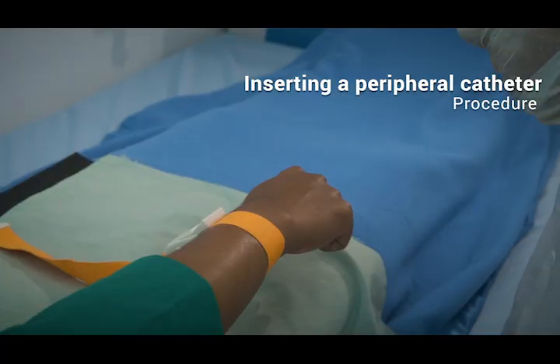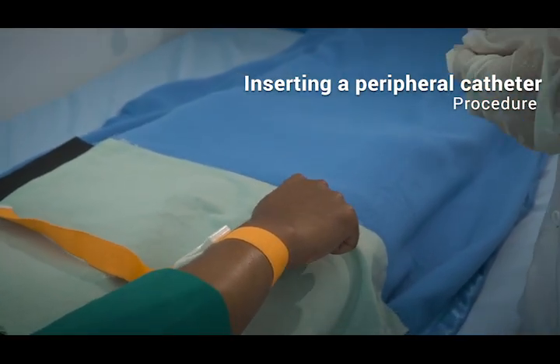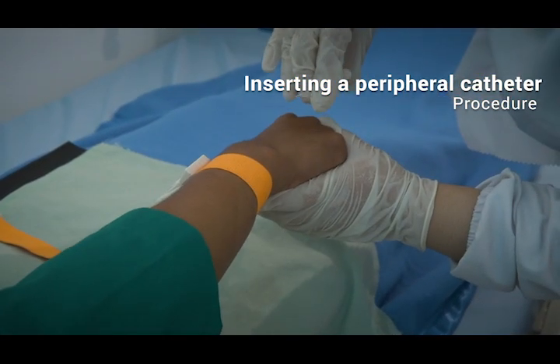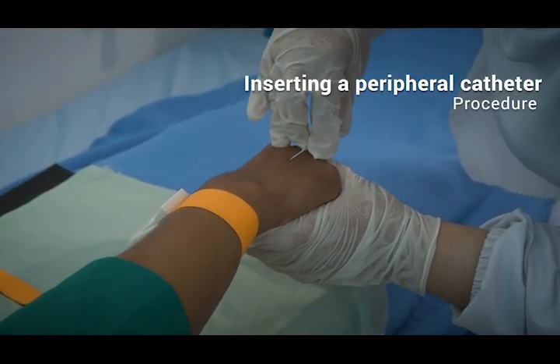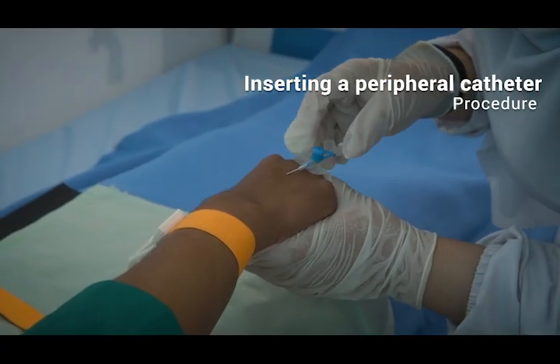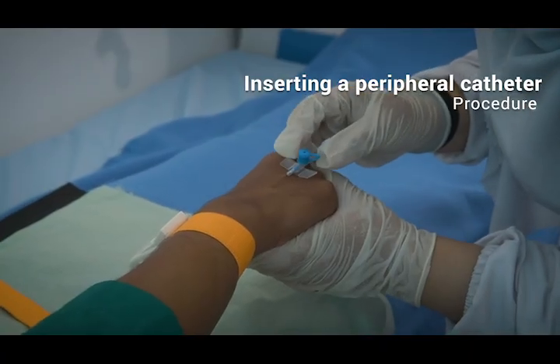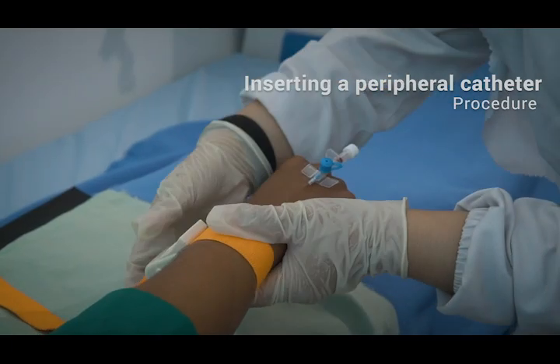Inserting a peripheral catheter. Stretch the skin below the puncture site using the thumb of your non-dominant hand to stabilize the vein. Tell the patient that you are about to insert the device. Place the short peripheral catheter on top of the vein at a 10 to 15 degree angle to the skin. Puncture the skin and anterior vein wall, watching for blood to appear in the catheter. As you continue to hold the skin, advance the catheter into the vein. Don't advance the catheter by pushing from the catheter hub to avoid contaminating the catheter hub. Release the tourniquet.